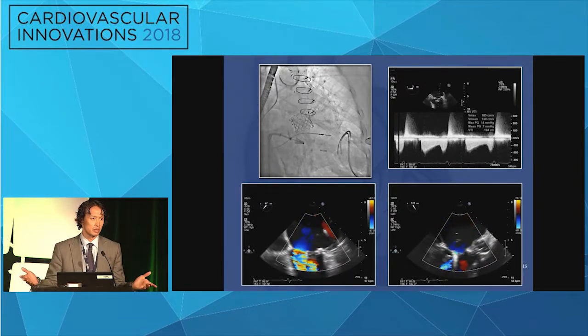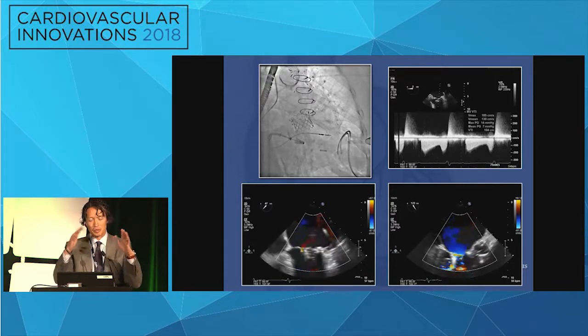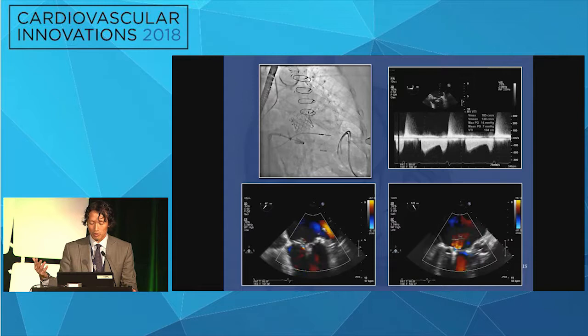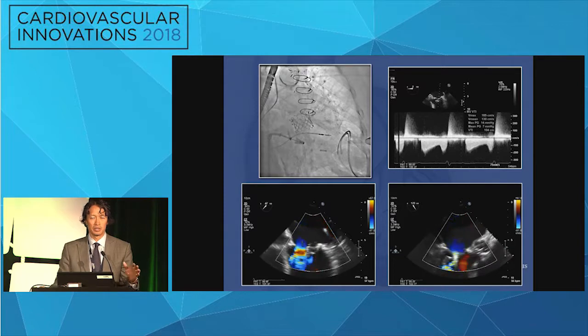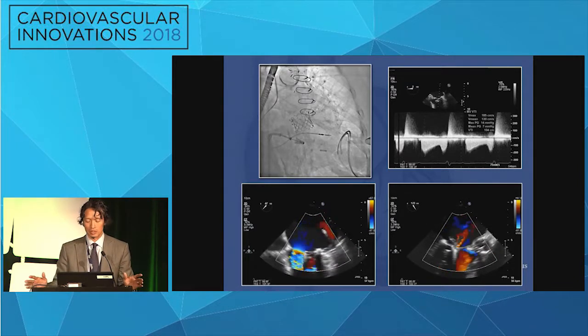So this is a trick you can do with mitral clip. You can open it up, not 60, 30 degrees or 60 degrees, depending on which way you view it, around 30 degrees. That got the gradient down to something more acceptable, around 7, and the MR, while it's not completely gone, is probably more survivable. And I'll tell you, the next day the gradient on the transthoracic was higher. It was in the 10 range, but you know what? It was the best that we can do, and we medically managed him, and I think he did okay. I can't remember what he did down the line, but this is the best that we can do.